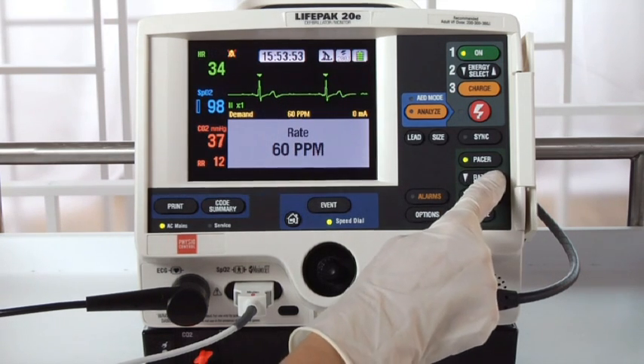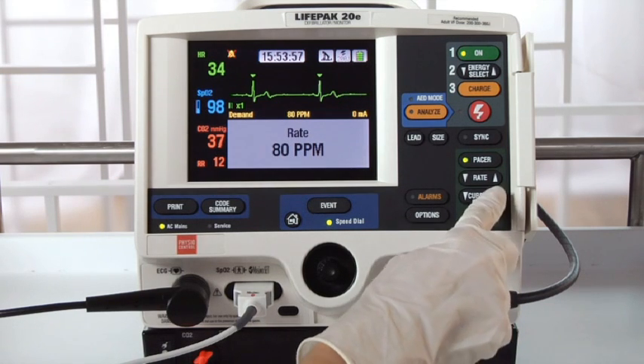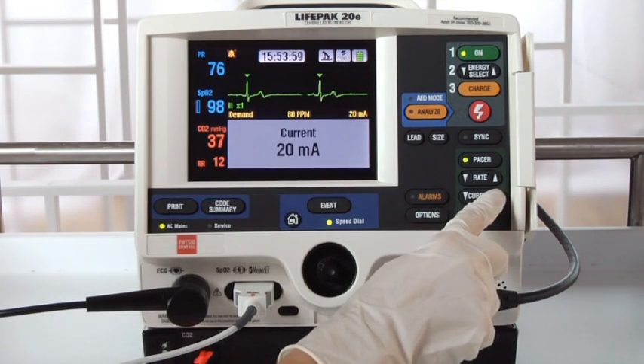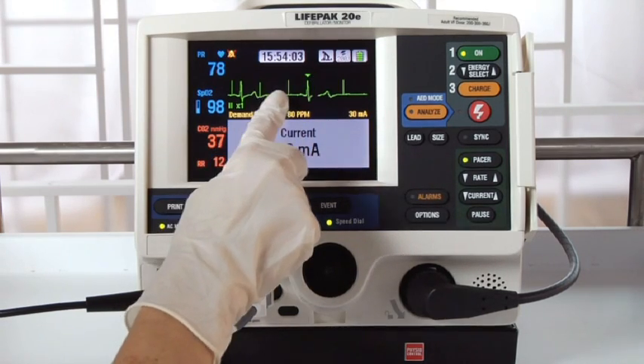Now press RATE. Press the up or down arrows to get the rate you need. Then press the current up arrow repeatedly to increase the pacing current. You can now see pace markers, indicating that pacing current is being delivered.